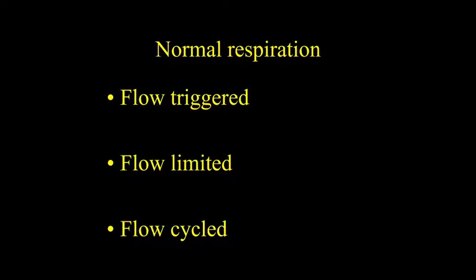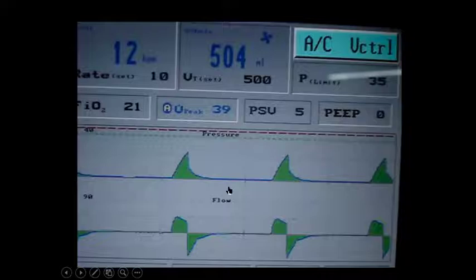So that is after a certain flow, you have to take a respiration. So that is a flow trigger. Flow limited: after attaining some flow, you have to stop taking the breath, and it is flow cycle. Cycling is also by flow.